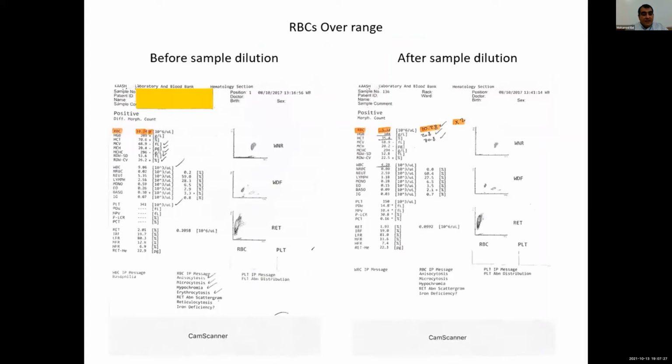This is one example of a patient having secondary polycythemia presented to our hospital with RBCs of 10.240, 10.2 millions. In such a situation, as I mentioned, we should do correction, as this RBC count is exceeding the instrument linearity or AMR, by using the saline.